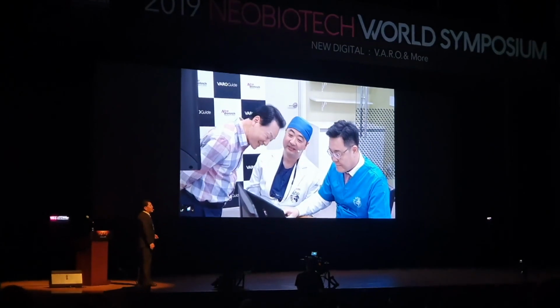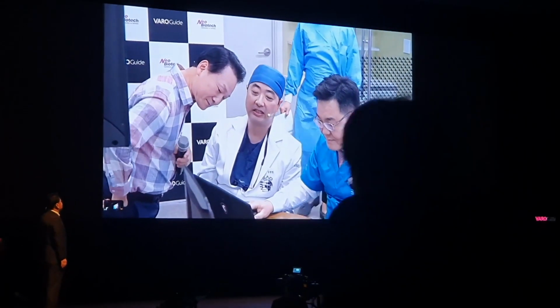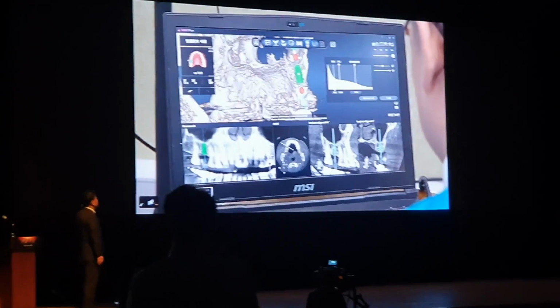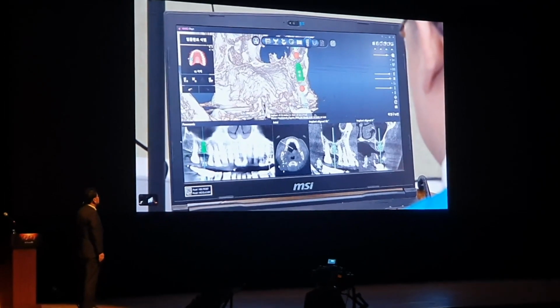Surgeon and patient is having a debate. So I want to plan for 4.5 by 10, but Dr. Ho demands 5.0 and 10 mm implant. So I might modify the plan to 5 by 10 mm.